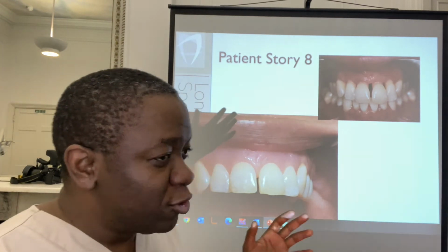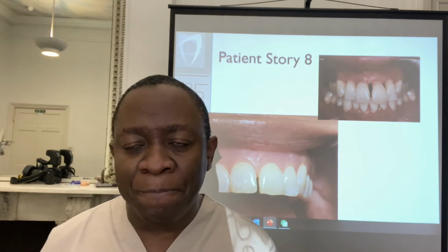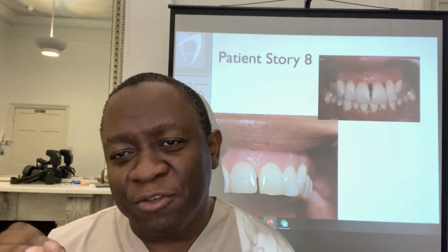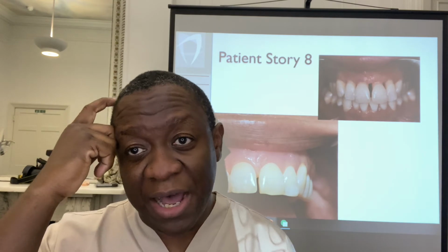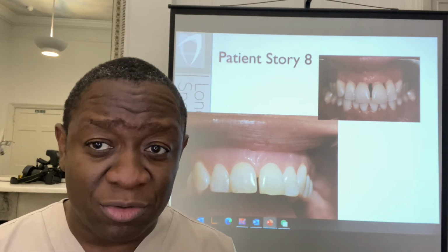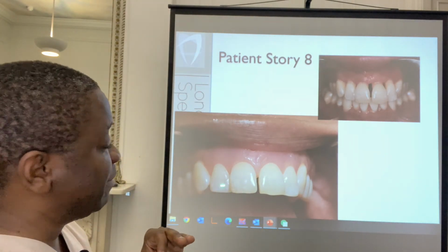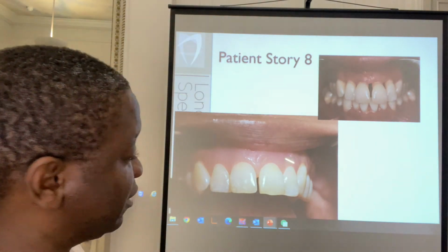So I said, and I always say this to all our patients, let's have a deal. Try my gum veneer, please, for 6 to 9 months. If you come back to me at 6 to 9 months and you say, I still hate your gum veneer, I promise you that I will place the porcelain veneers or the composite buildups myself. I enjoy doing them, but I also know that there are limitations. In the long term, the easiest way of keeping these front teeth is with this gum veneer.